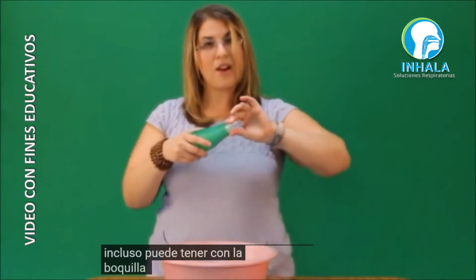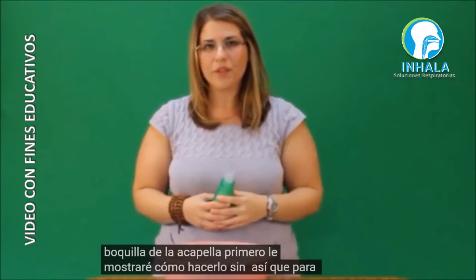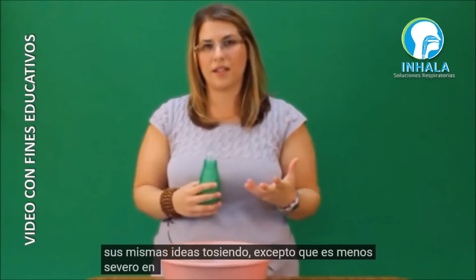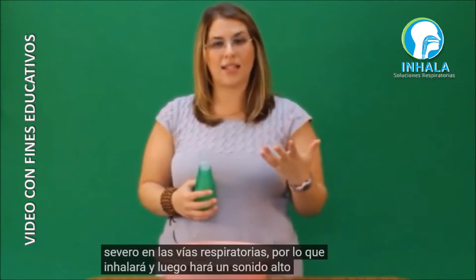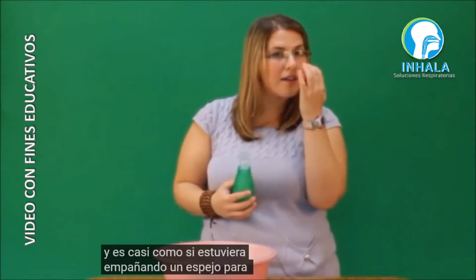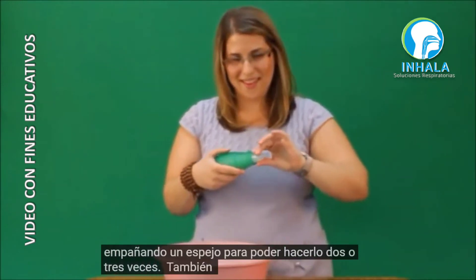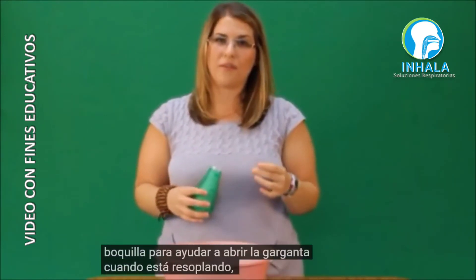Another technique you can use is the huff. You can even huff with the mouthpiece of the acapella. First I'll show you how to do it without. To huff, it's the same idea as coughing except it's less harsh on the airways. You're going to breathe in and then make a 'ha' sound — it's almost like if you're fogging up a mirror. You can do it two to three times.